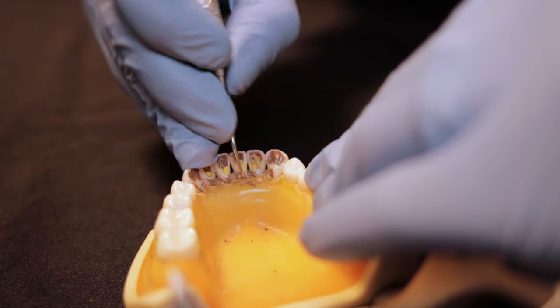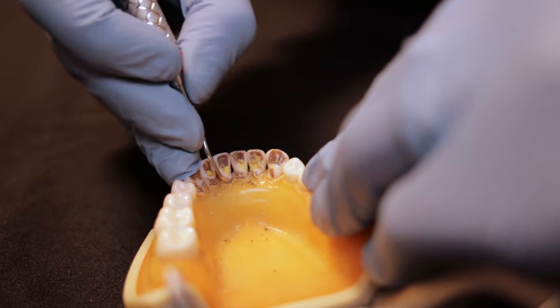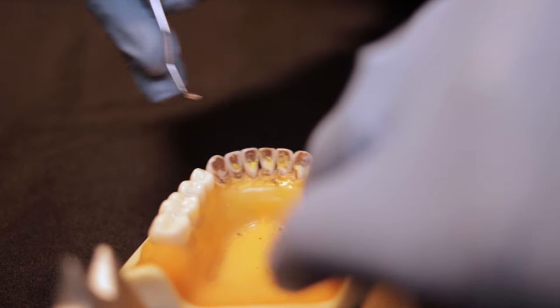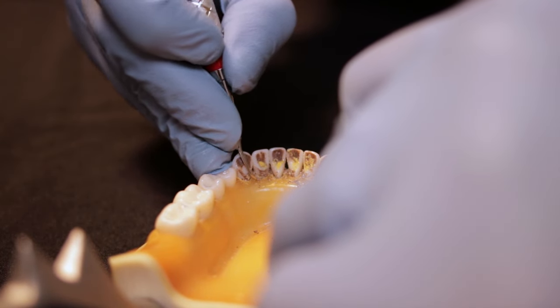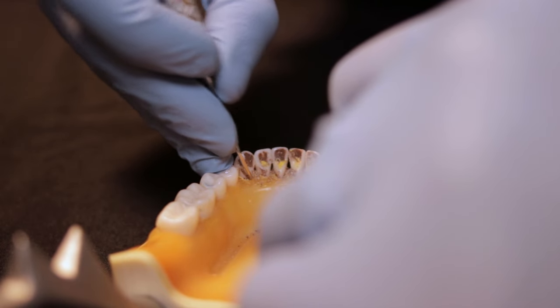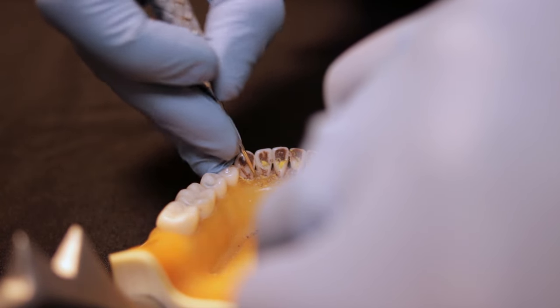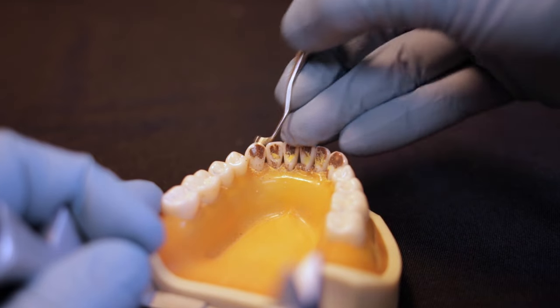You can see I'm rocking on my fulcrum and not using my fingers to tug, because with this much calculus I'll get fatigued. Use your fulcrum to get the momentum for scaling. Use your three points of pressure: if you feel like you're slipping around on the tooth, your pressure is wrong. You need pinch pressure against the handle, fulcrum pressure against the tooth, and lateral pressure — your thumb pushing against the side of the tooth. All three pressures should be balanced. Now we've switched to surfaces away, going through and getting the straight lingual.